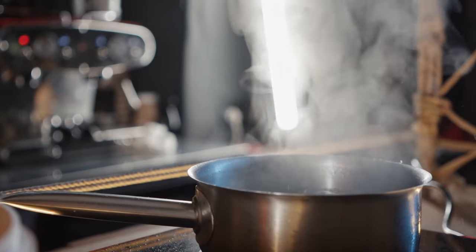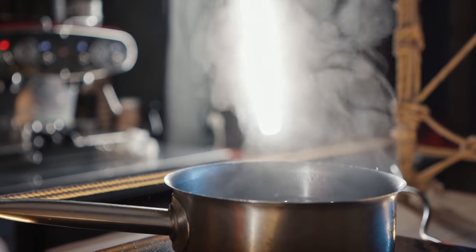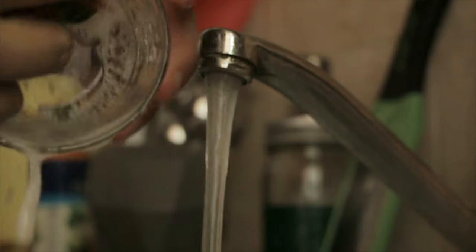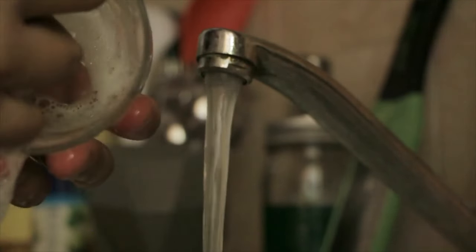Buy a new one — don't buy a used one. I've seen moms online say just boil it twice. That doesn't work. Please don't use one that another mom has used. The first time you use it, wash it thoroughly and boil it for 10 minutes. After that you can just hand wash or put it in the dishwasher between uses.